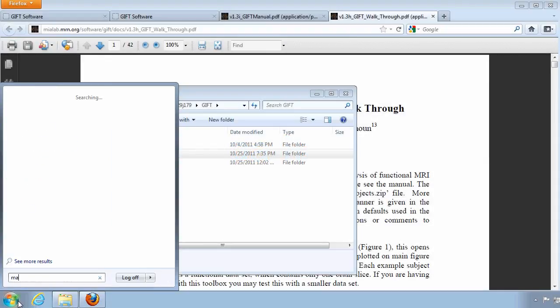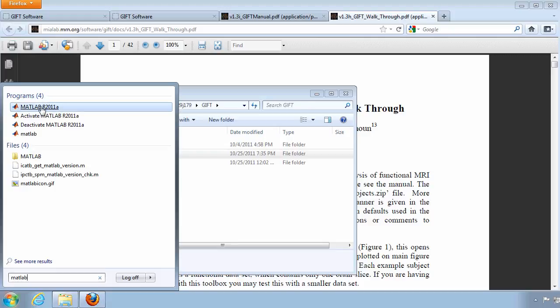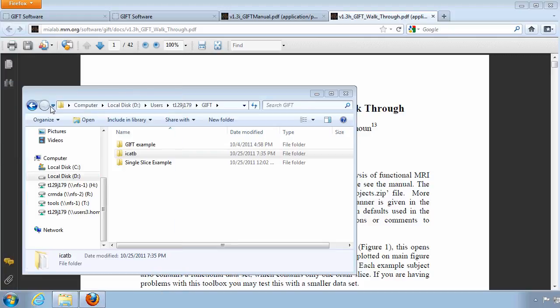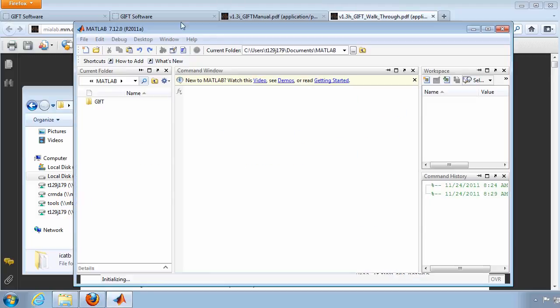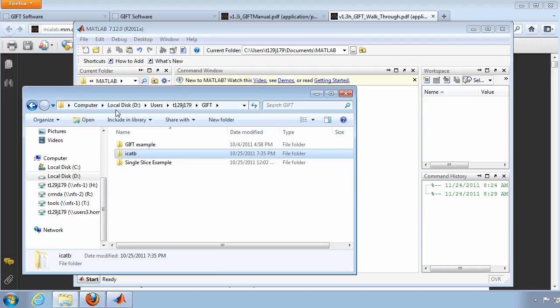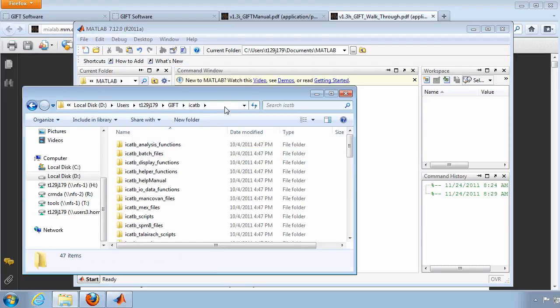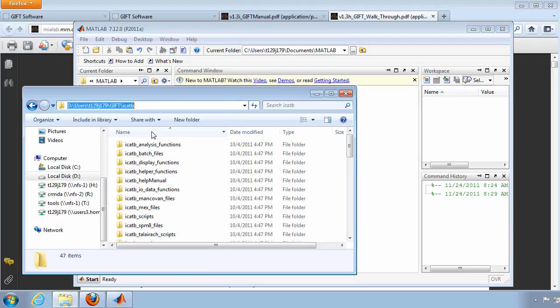Open the MATLAB program by typing MATLAB into the Start menu search bar. In the MATLAB command window, tell MATLAB where to find the Toolbox programs by typing addpath as one word, and pasting the path to the ICATB folder. You can copy this from the Windows Explorer, then paste it after addpath and press ENTER.